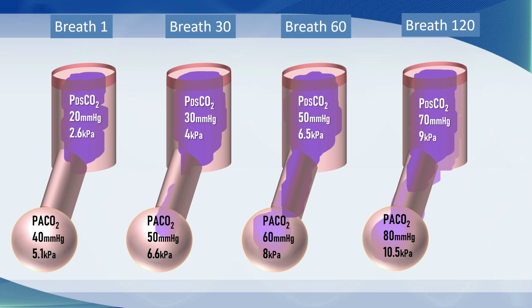And when you see this, you need to do something about it. Either you wait and see how bad it gets, and it will get bad unless it stabilizes, or else you need to put the patient on a ventilator or give them some manual inspiratory support. But you do need to start clearing CO2 from the airways, because that represents arterial CO2, which really seriously acidifies the blood and will cause profound vasodilatation.